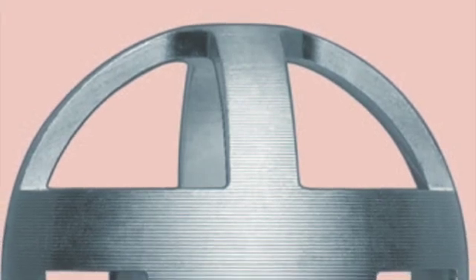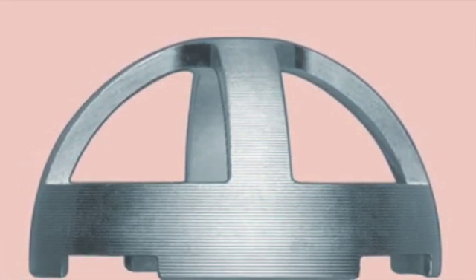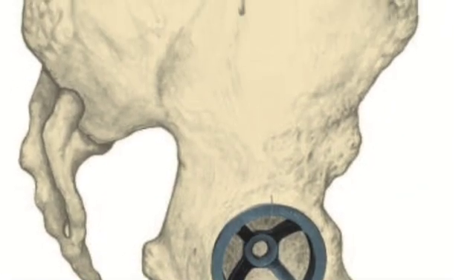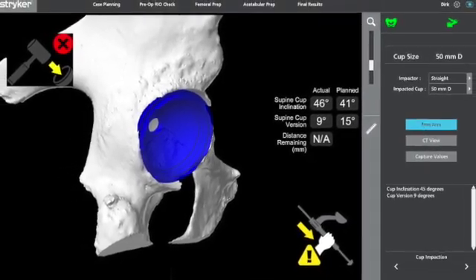Once you've prepared the bone, grab one of the Trident window trials, one to two millimetres smaller than the last reamer you've used, and insert that onto the impaction handle. This then gets inserted into the acetabulum and pushed into place, and you need to take a recording of the acetabular component in a reduced position.